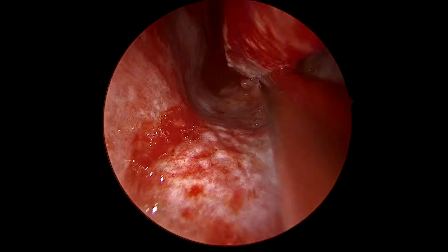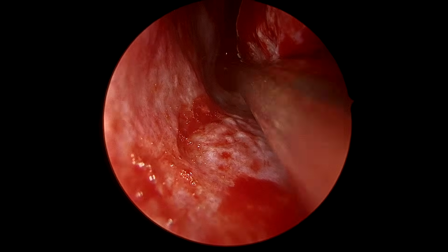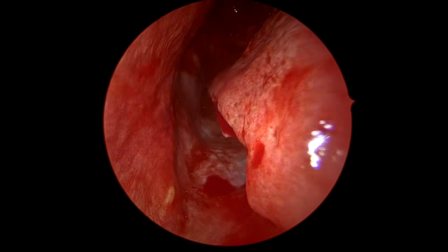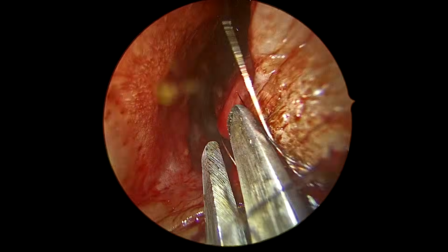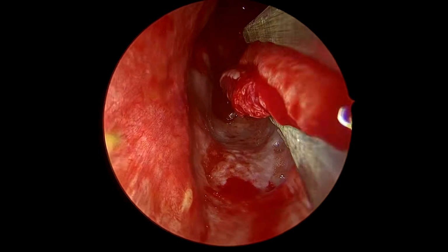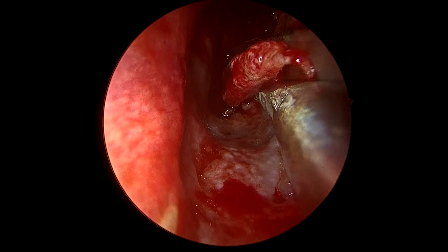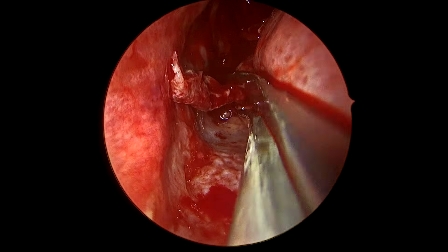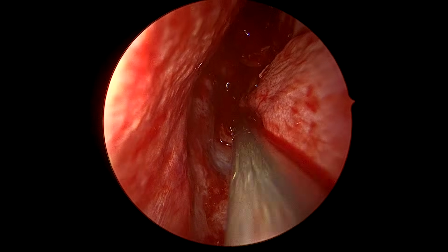Remember, do not resect the inferior turbinate completely because it will cause empty nose syndrome. But partial resection and removal of a strip of bone inferiorly does help the patient remain nasally patent. So this is the resection of the bone, and it's partial, it's not a complete resection of the bone. Partial resection of the inferior turbinate will never cause any empty nose syndrome, but this will keep the nasal cavity open. It's a very effective technique to have nasal patency.